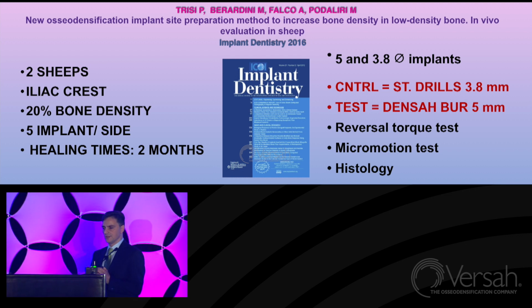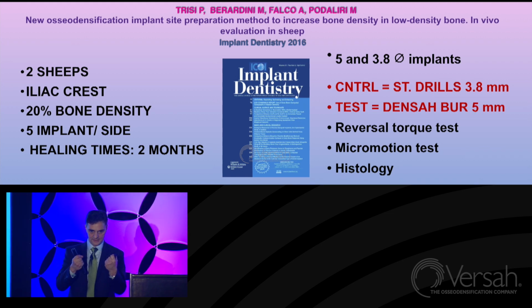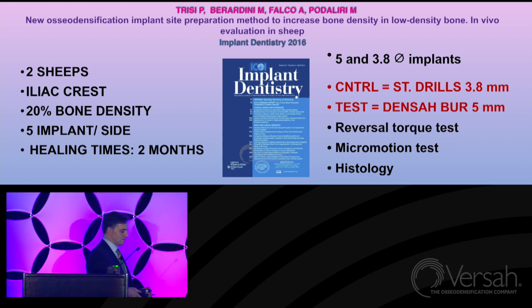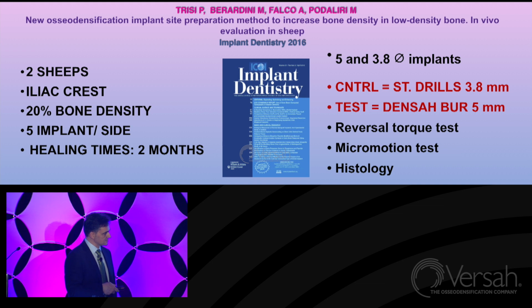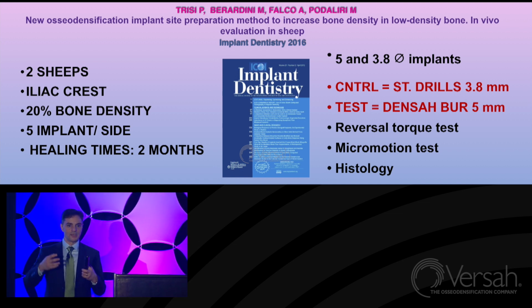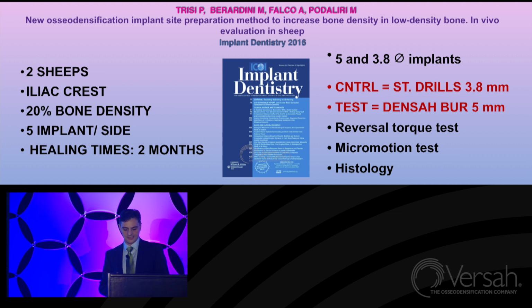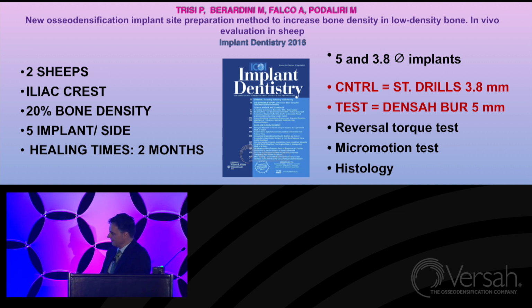But at the time of surgery, we thought that we could also evaluate the possibility of the drills to expand the crest and to place 5 millimeter implants in the 5 millimeter crest, as Dr. Salah showed us this morning. So in the test group, we placed a 5 millimeter implant diameter. In the control, we could only place 3.8, because by placing 5 millimeter implants, we would have had dehiscence on both sides. So we could not place 5 millimeter implants in the control side. It should have been better, but then we could not compare the results after healing. And this is the test we did after healing.